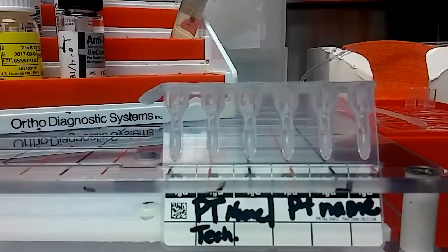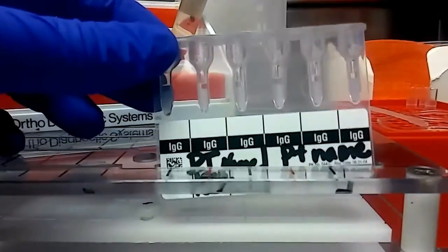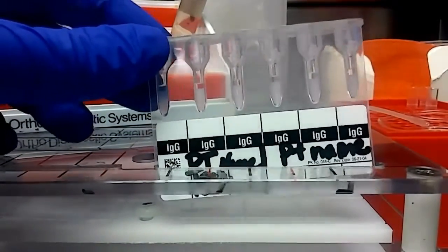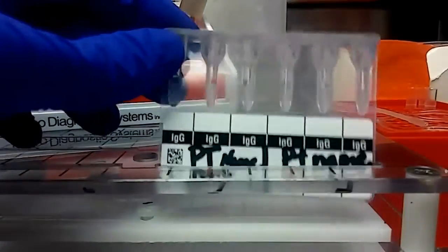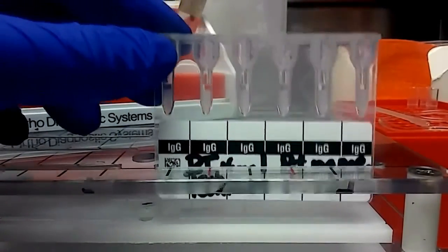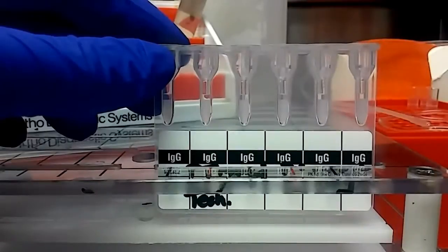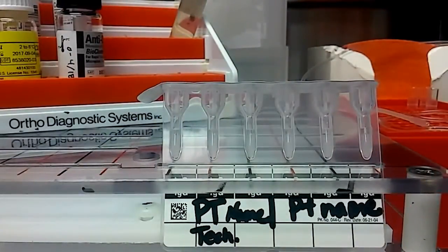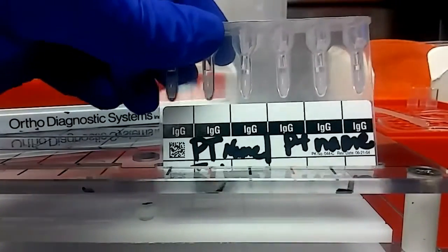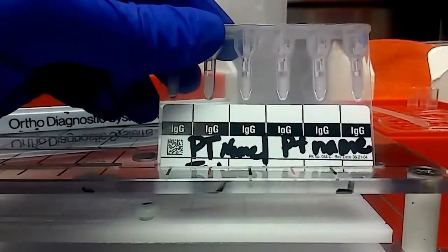I'm going to be doing this type of testing in gel. This is what a gel card looks like. IgG is what we use — that's what's in the gel — to find out the antibodies. We do a screen off of three screening cells, so I'm going to label these one, two, and three. Each card can fit two patients.